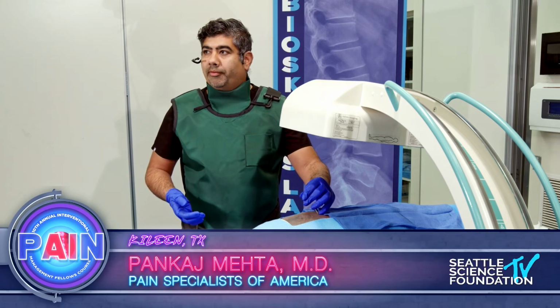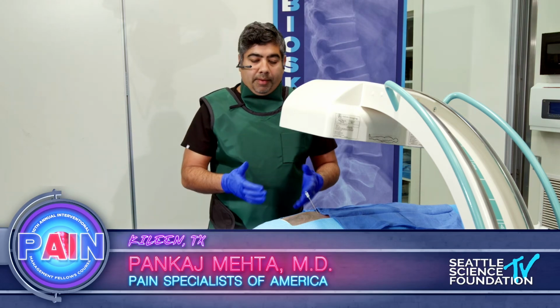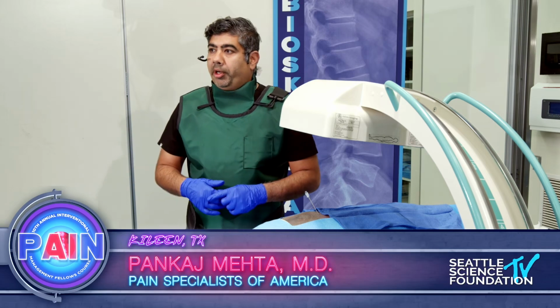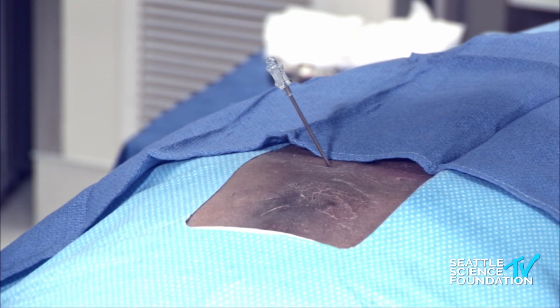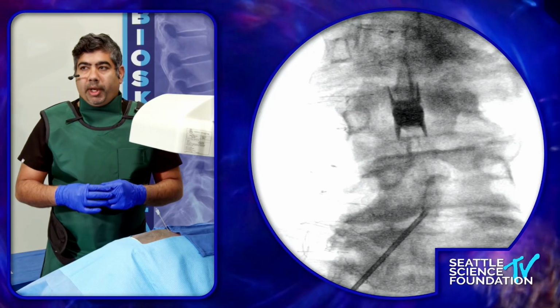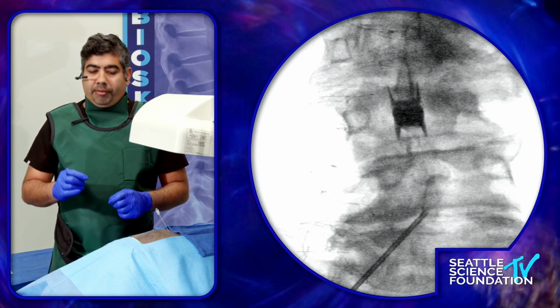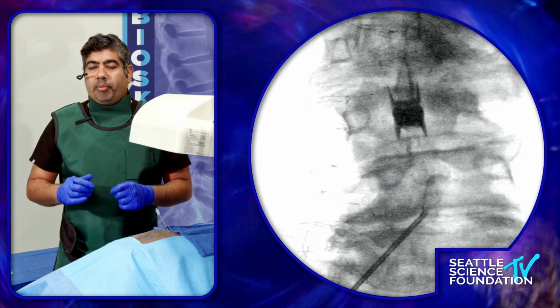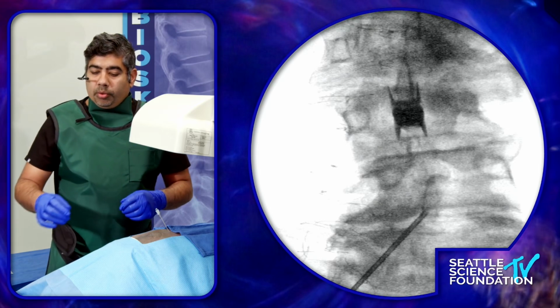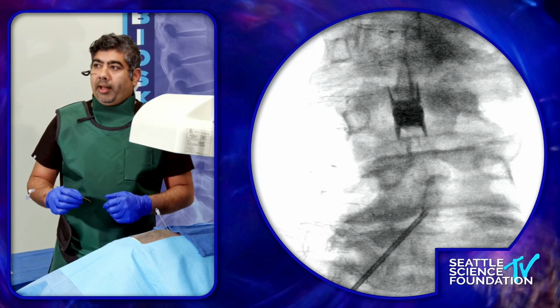For the interest of time, what I did was, if you look at the cadaver, I've got the needle placed in. And what Ramo was talking about, even to date, I make my trajectory contralateral to where I'm going. You can see here, if Ramo, you can point out, you start off and the skin entry is about a vertebral body lower. And then you get into the interspinous and the interlaminar space. You want to be a little bit in the upper part of the space, right below the spinous process. And the key step here is to have the needle placed perfectly midline and also in the higher part of the space below the spinous process, and follow the trajectory which you have mapped out, which Ramo talked about, to go towards your destination, which is the contralateral foraminal space, in this case, the right L4.